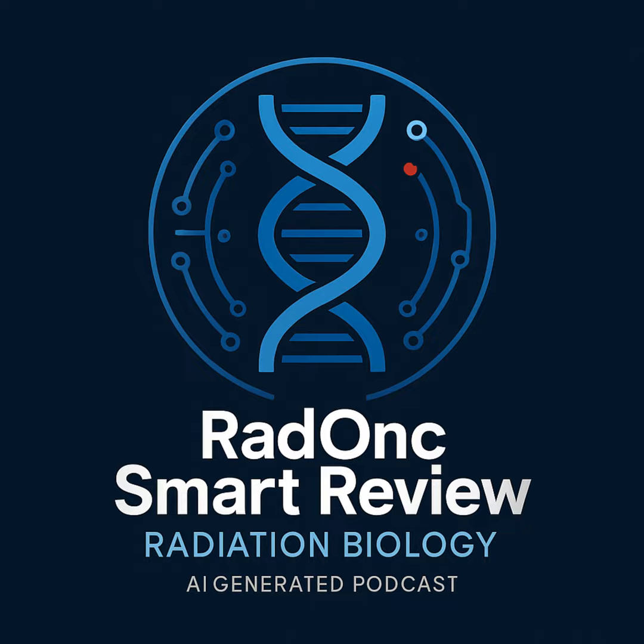Because the PET scanner itself is basically a big ring of detectors surrounding the patient. And it's programmed to look for pairs of these 511 keV photons hitting detectors on opposite sides of the ring at almost precisely the same instant, within nanoseconds. Coincidence detection. That's the term. If 2 detectors directly opposite each other signal a 511 keV hit simultaneously, the scanner knows that the annihilation event must have happened somewhere along the straight line connecting those 2 detectors. It doesn't know exactly where on the line, but it knows the line itself, the line of response.